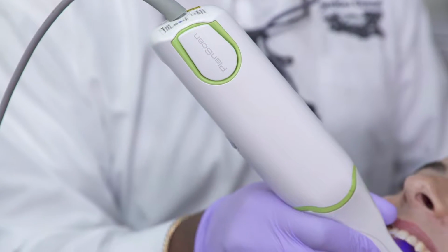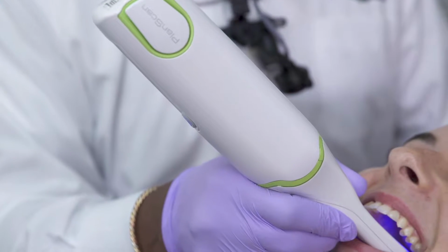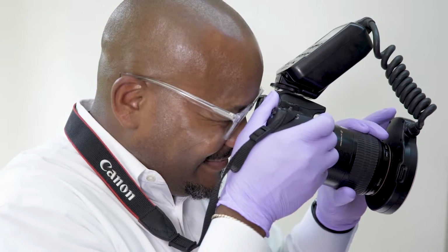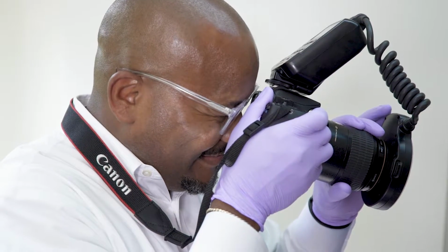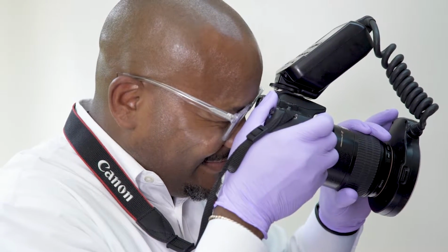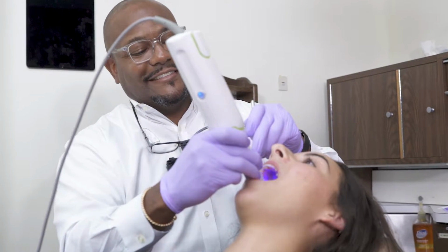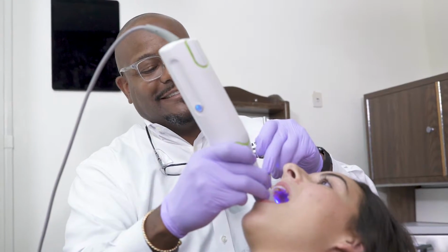So digital smile design is a great tool that we use in our office to basically simulate a smile on a patient. We use a combination of video and photography. The photography is used to kind of place the patient's teeth, so we get an idea of where the patient's teeth are in their mouth. And also we use an intraoral scanner to then scan their teeth and combine that with their photo.